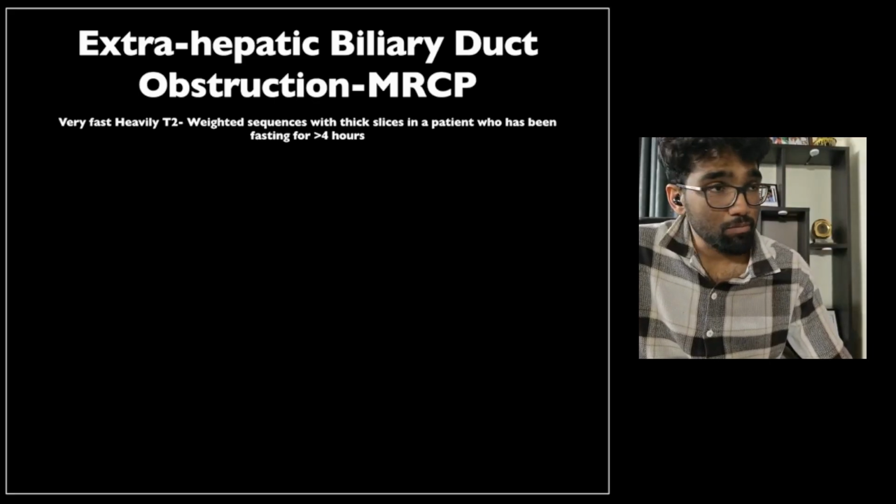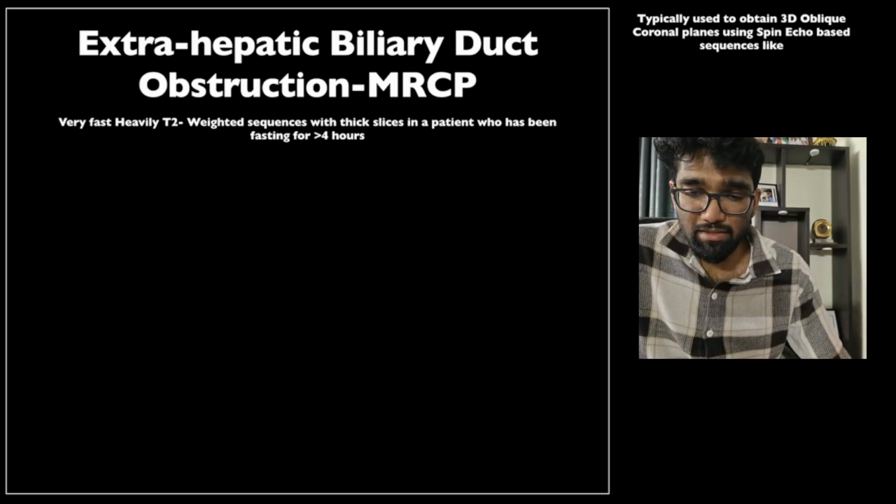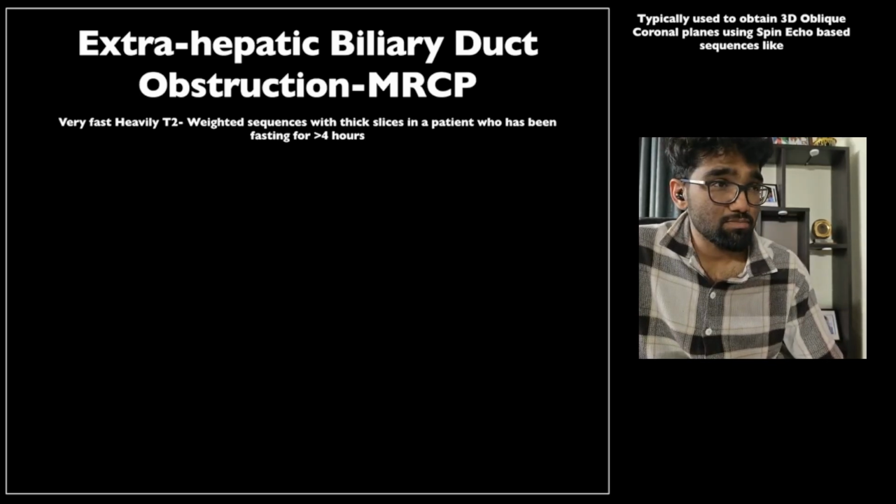So this is just for completion's sake, but typically we use 3D oblique coronal planes, and we rely on something known as a spin echo based sequence.